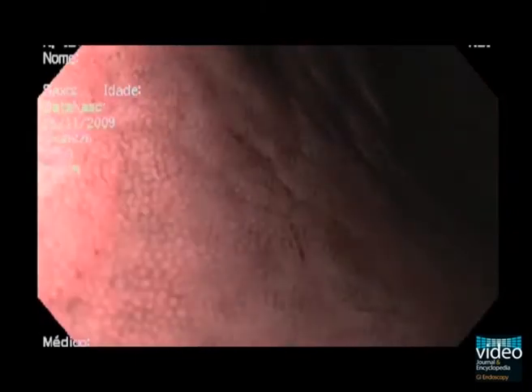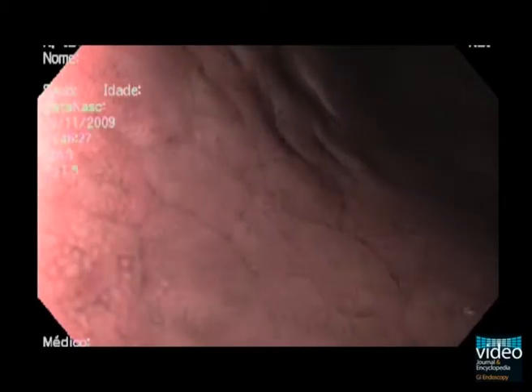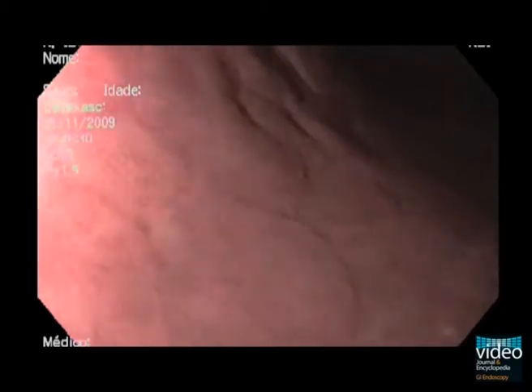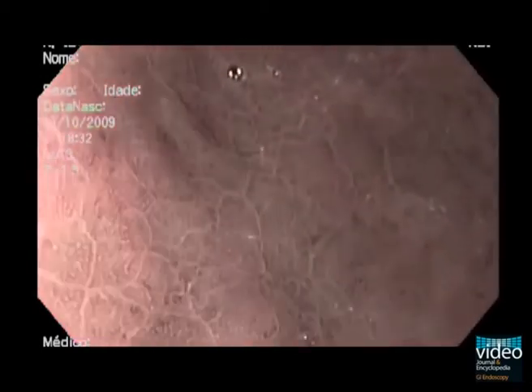In the gastric body, regular circular mucosa is surrounded by regular thin vessels, not in the centre of the gland as in the antrum.